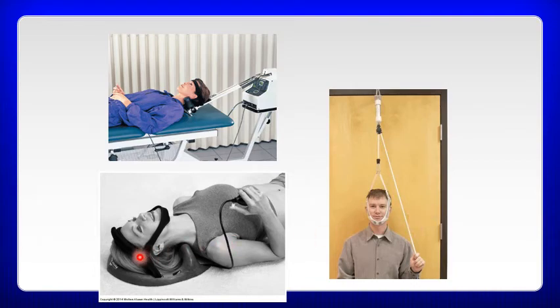This is slightly newer here. This is what's called a pneumatic traction device. You can see she's got an air pump. As she's pumping that, there's an air bladder that basically creates a tractioning effect on the spine, and you can actually get an alternating hydration and milking of the intervertebral discs as you let air in and out of that little region. That's referred to as pneumatic traction, as you move air in and out of that particular unit.